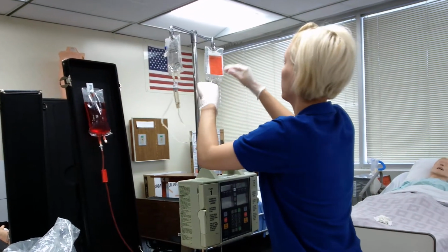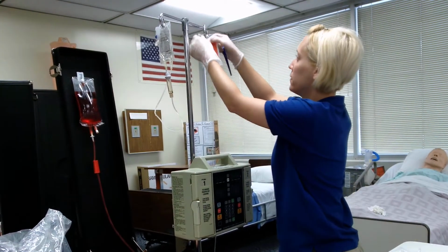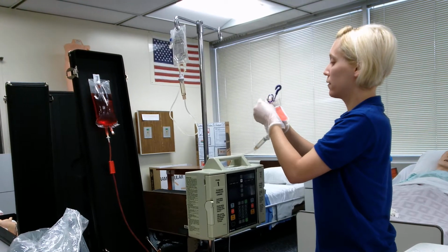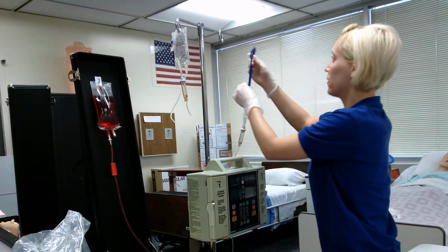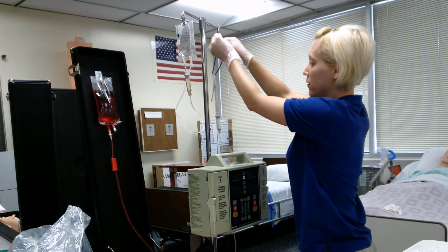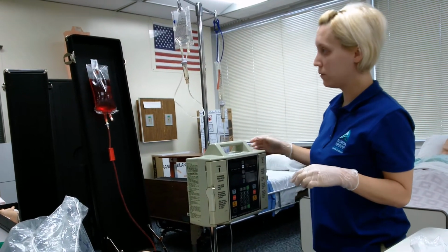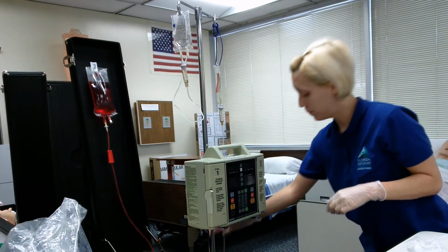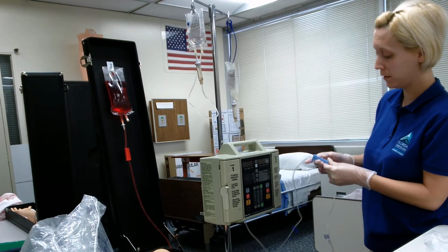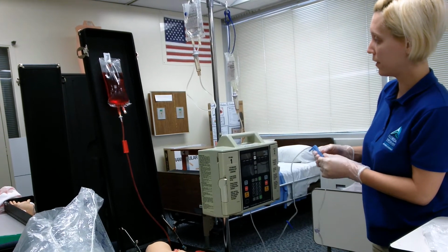That would be labeled. I'm going to drop down the primary. I'm going to stop my primary. I'm going to clamp that.